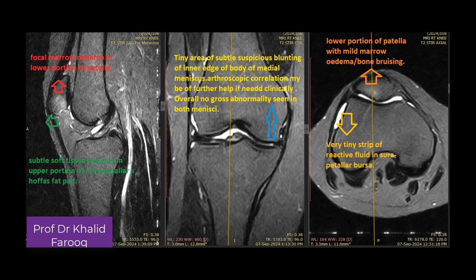Bismillahirrahmanirrahim, Assalamu alaikum warahmatullahi wabarakatuh. Here we have an MR examination of the knee joint — this is the right knee and we have three images. This is a sagittal fat suppression T2-weighted sequence, this is the coronal T2 fat suppression sequence, and this is the axial T2 fat suppression sequence.